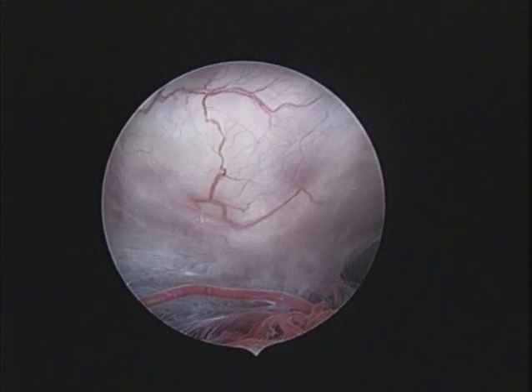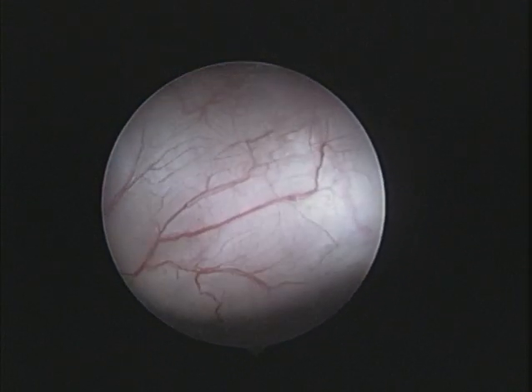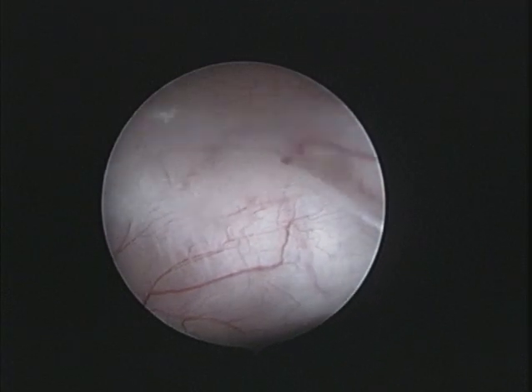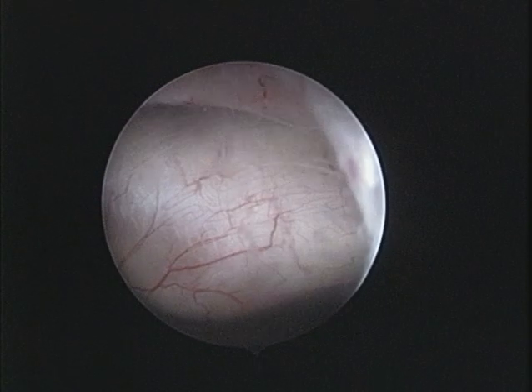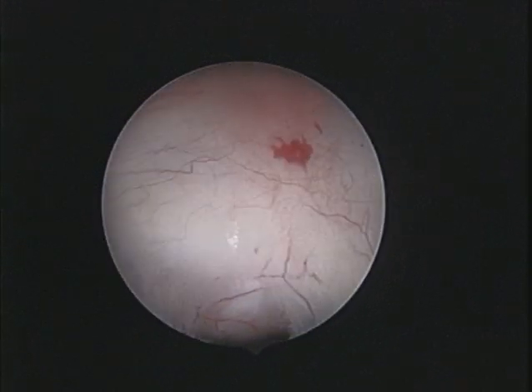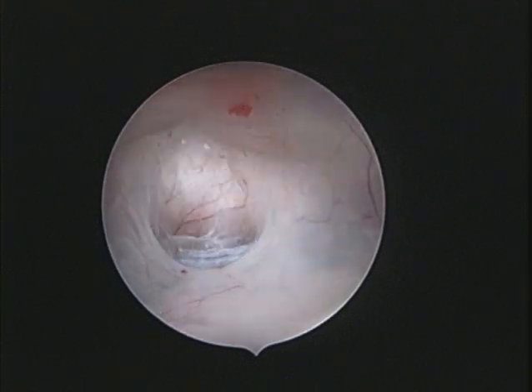The endoscope is carefully withdrawn from the cistern to the lumen of the third ventricle. Note the movements at the edges of the endoscopic third ventriculostomy associated with the restored pulsation of the cerebrospinal fluid.